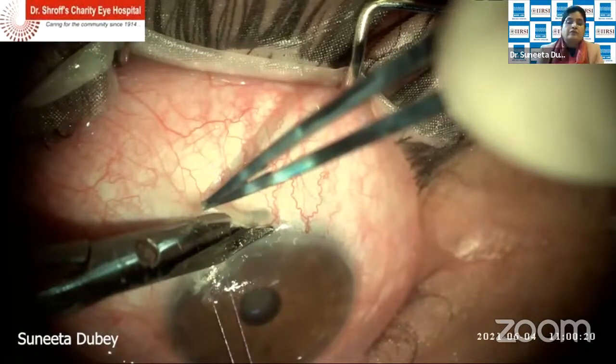Okay, so Reena, what kind of suture? I used to use superior rectus bridle, but over the years I've given up on superior rectus bridle suture. I either use a corneal stay suture or I use the speculums, the one with the larger arm inferiorly. I've moved to that long speculum mostly, but in some cases where the eye is very deep set or your speculum might not be able to really expose the superior conjunctiva, in that scenario, I might take a corneal stay suture. Okay.